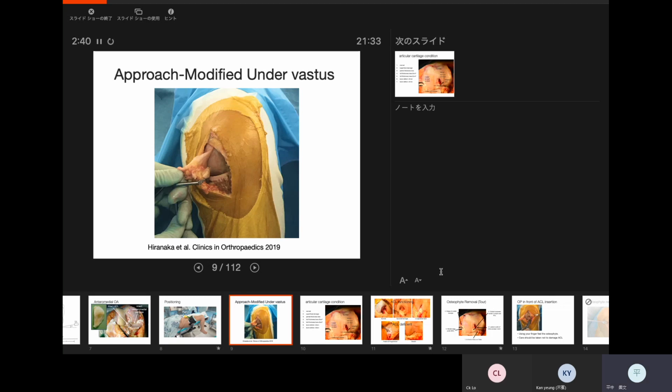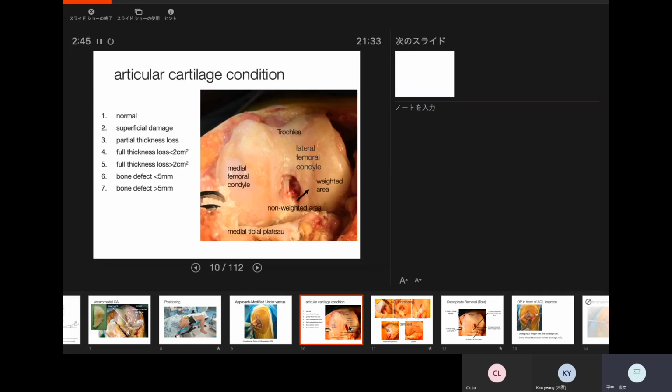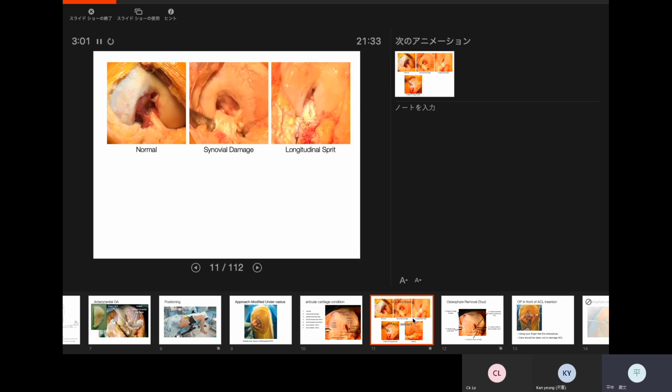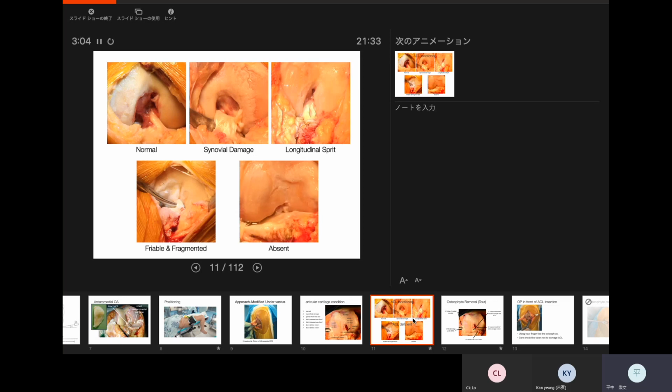Okay, and then open the joint and make sure of the cartilage status, especially the medial side cartilage wear and the lateral side normal cartilage, along with the intact ACL. And this is the ACL grading system: normal, synovial damage, and longitudinal split; ACL intact, functioning, and friable, fragmented, and absent. They are actually deficient. That is a contraindication of UKA.